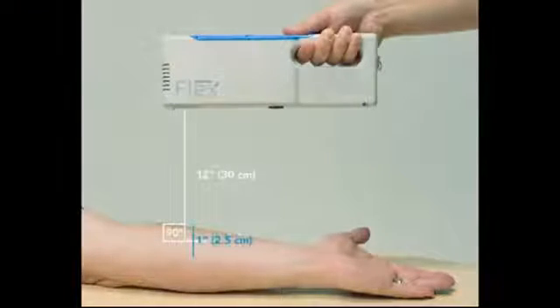There is a 1 inch window or approximately 2.5 centimeters in either direction where Flex remains in focus, helping to account for patient movement.